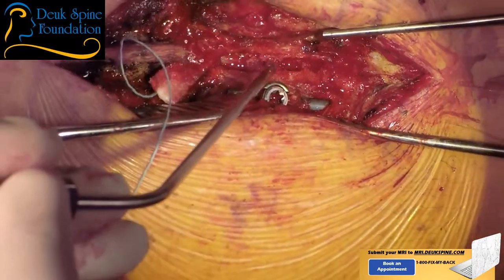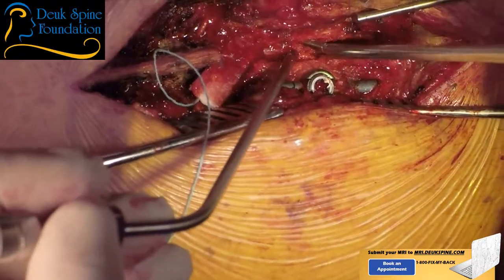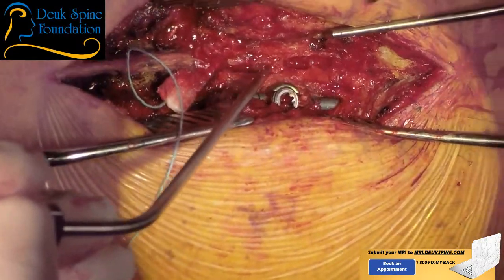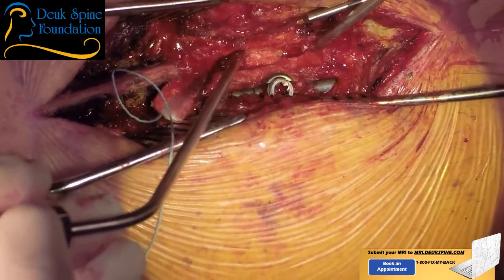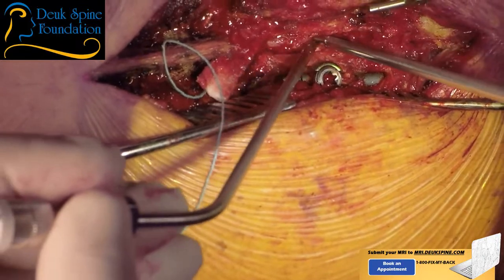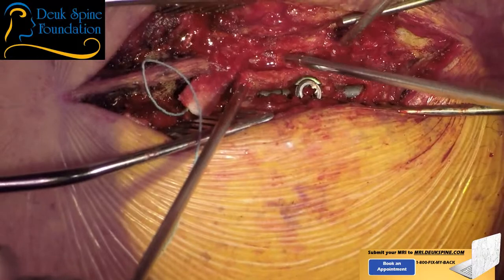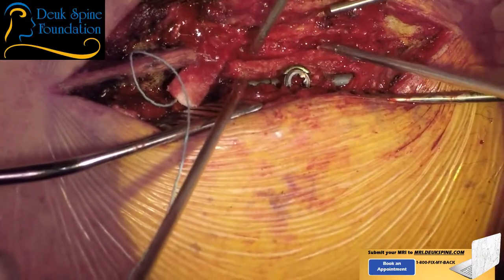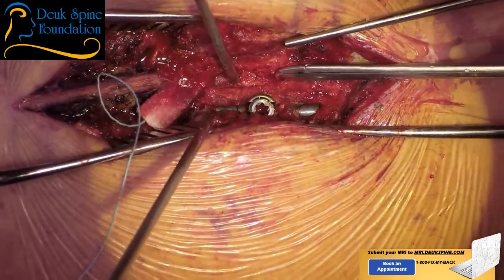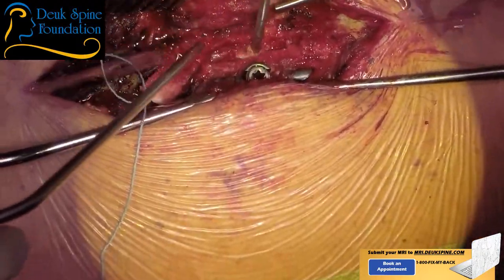I've drilled the bone down to an eggshell. That's the top of the lamina right there. You can see all this ligament just sitting there. And that's what's digging into the spinal cord, this ligament. So I think I might be okay, because I normally like to get this stuff from bottom up, cutting through that junction right where the facets are on the side. I like to go up, because you get onto the dura here, in that plane, and you just bite, and then bite, and you're golden.